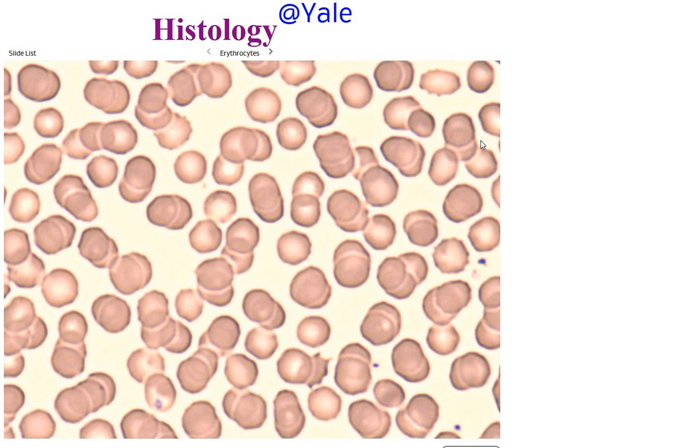First are going to be our granular leukocytes. So these are based on physical appearance. Granular leukocytes will contain granules. They have a grainy sand-like appearance on a slide. So we'll have three types of granular leukocytes.